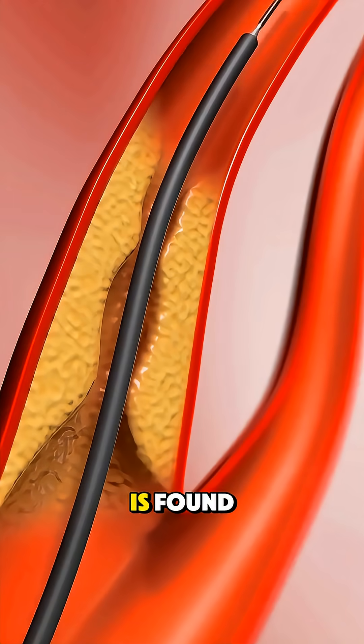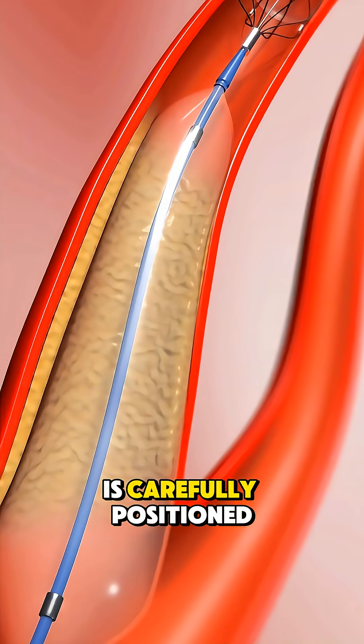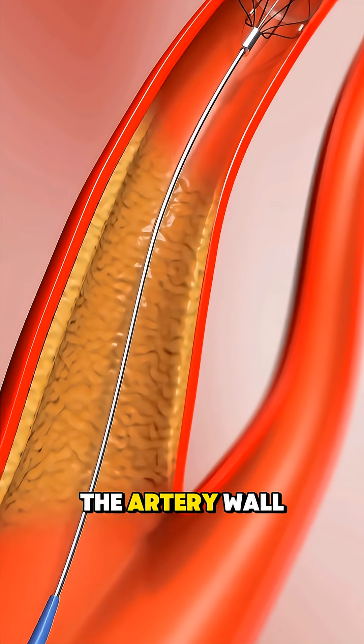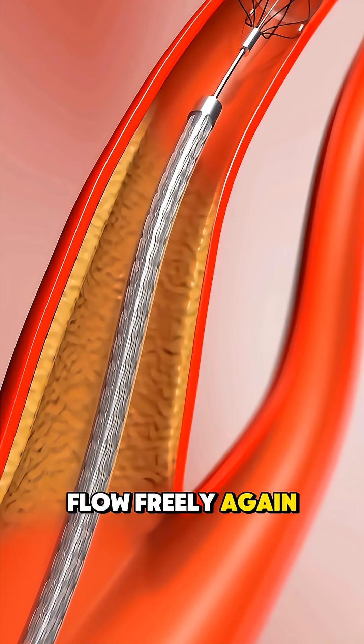Once the blockage is found, a small balloon at the tip of the catheter is carefully positioned and gently inflated. This pushes the fatty plaque against the artery wall, widening the pathway so blood can flow freely again.